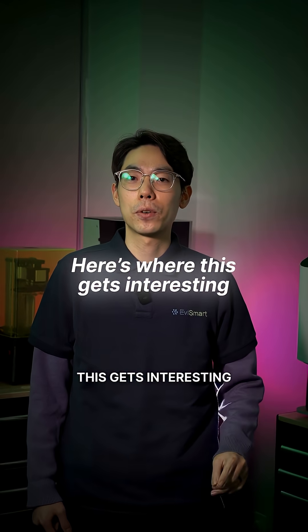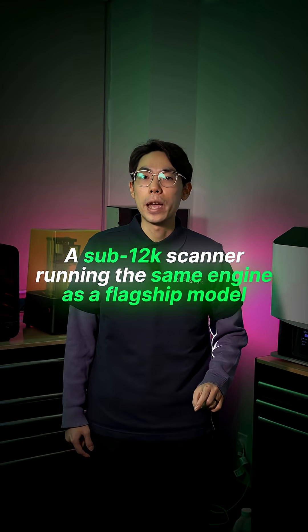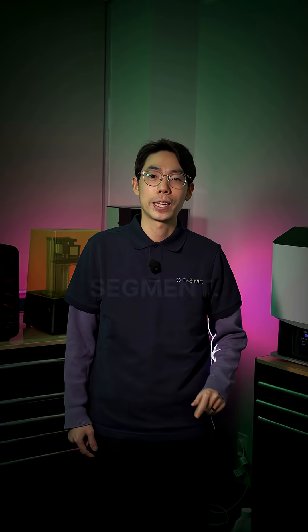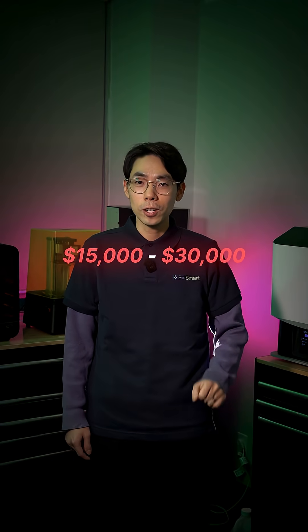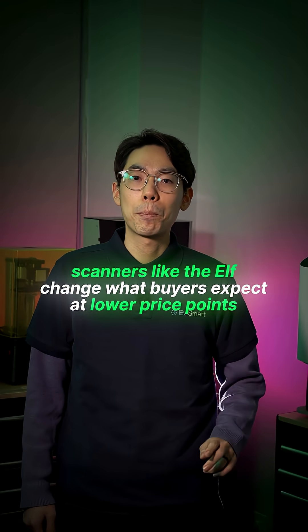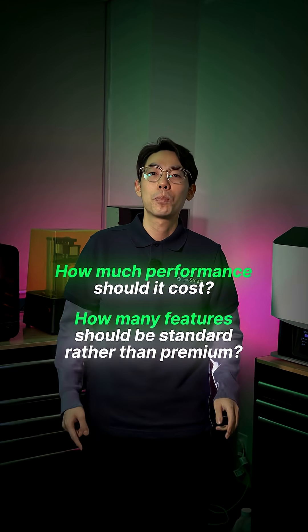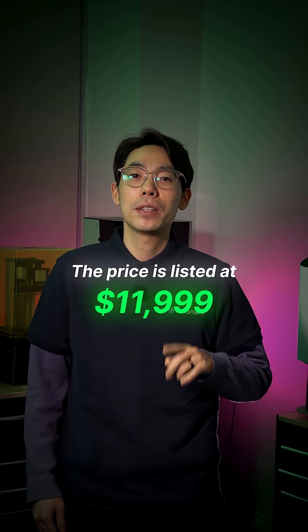Here's where this gets interesting for the market. A sub-$12K scanner running the same engine as a flagship model puts pressure on every manufacturer in the mid-range segment. If other companies continue to sit between $15,000 and $30,000, scanners like the ELF change what buyers expect at lower price points. It raises questions about how much performance should cost and how many features should be standard rather than premium. The price is listed at $11,999.